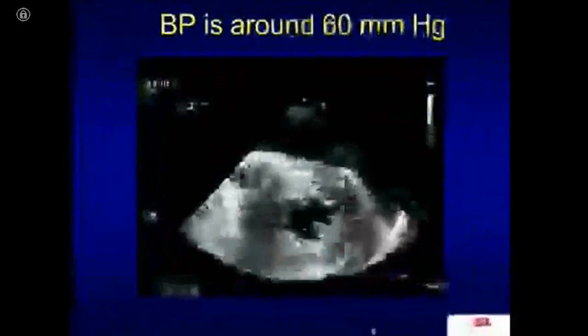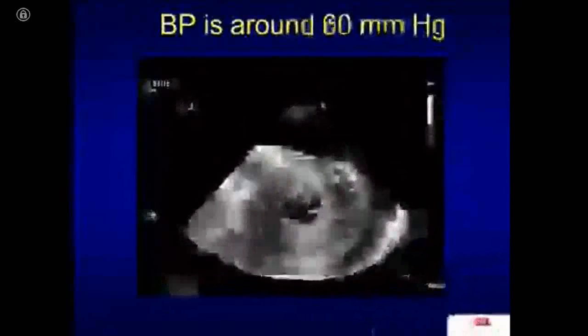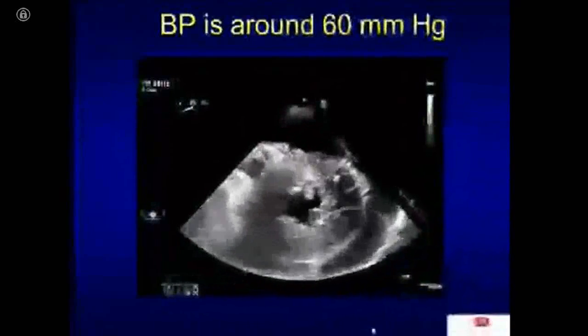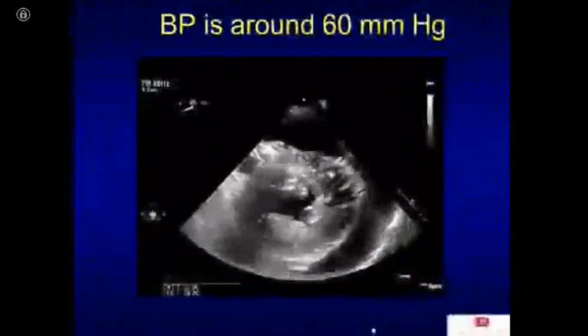And this time I called the cardiac surgeon and I said, what am I going to do? And usually by 800, 900 cc, now I had drawn 1 liter of blood. What would happen is I would pull the blood out and you could see there's no effusion, and you wait for about a few minutes and then you can see it's filling up again.